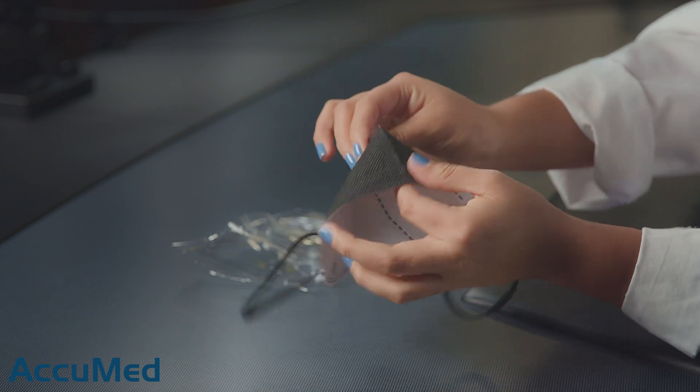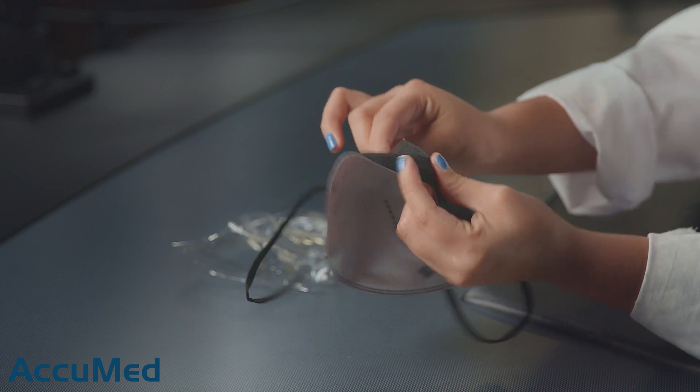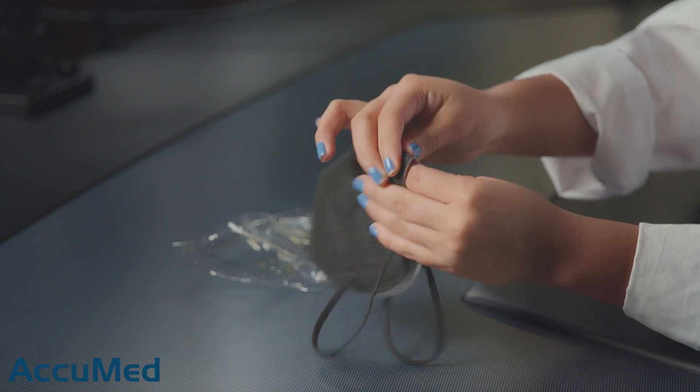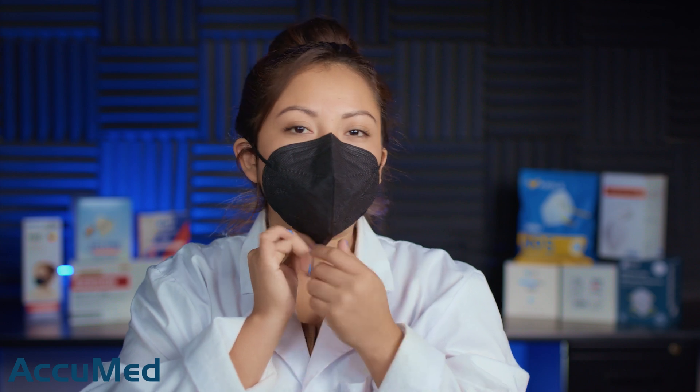The nose wire is actually not bad. It's not too flimsy, but it does feel like it's a plastic nose wire. Let's go ahead and take a look at these straps. These are pretty good — I'll grab another one since I already stretched these out. They are a little bit gummy, but nothing too crazy.